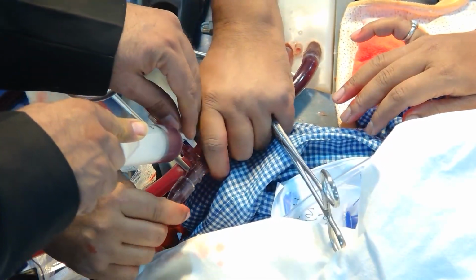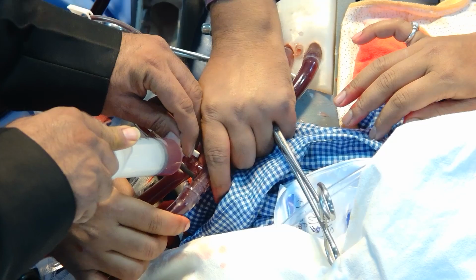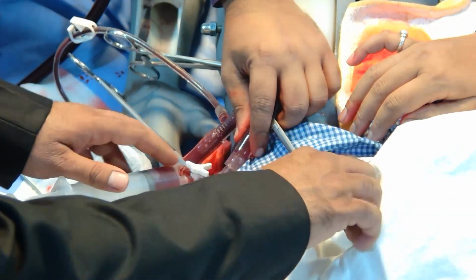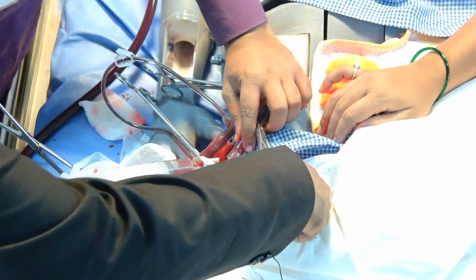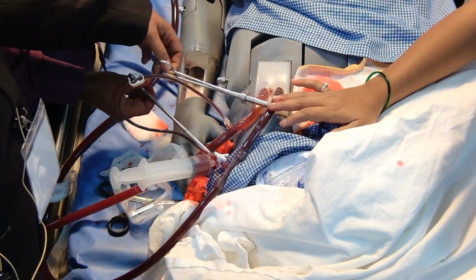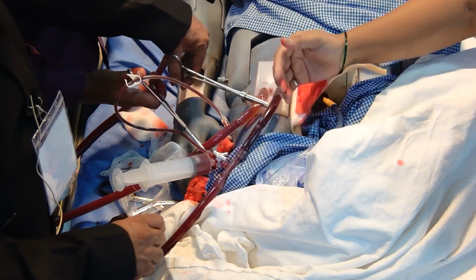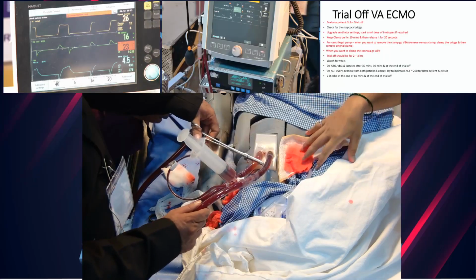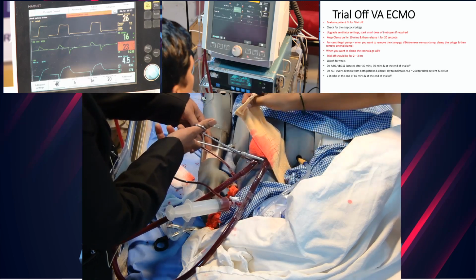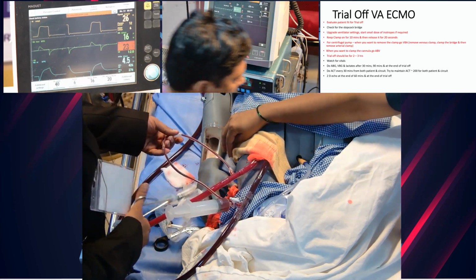So once de-airing has been done properly, then you have to release the clamp. Okay. First, always when you release the clamp, release the venous clamp first and then the arterial clamp. Okay. And you have to keep the bridge close.